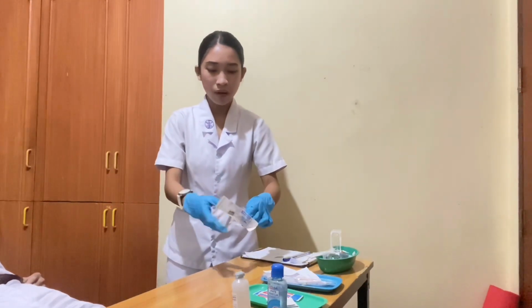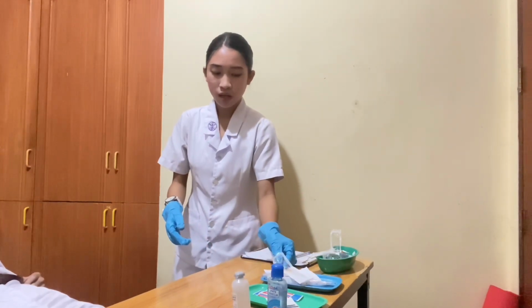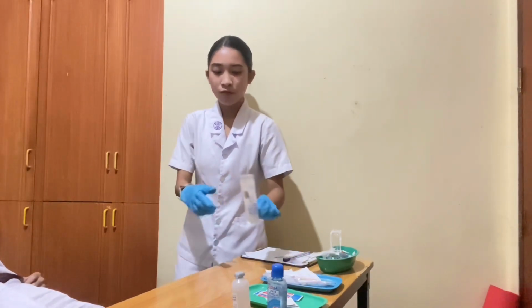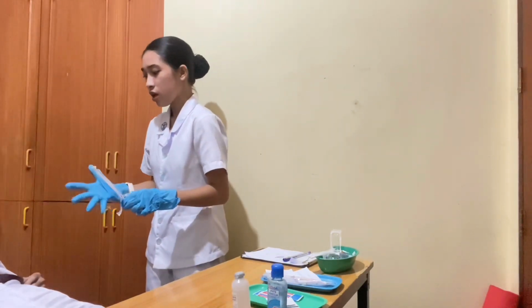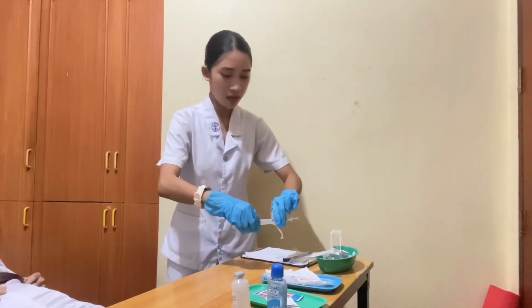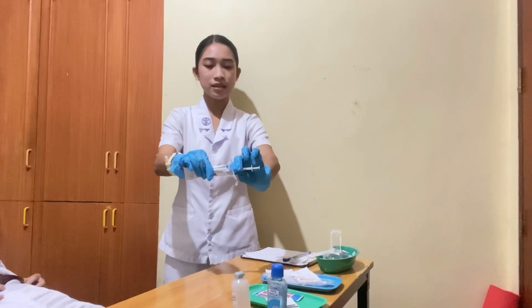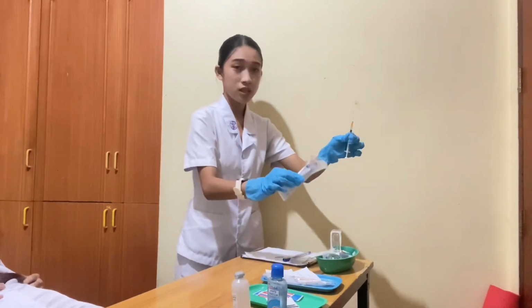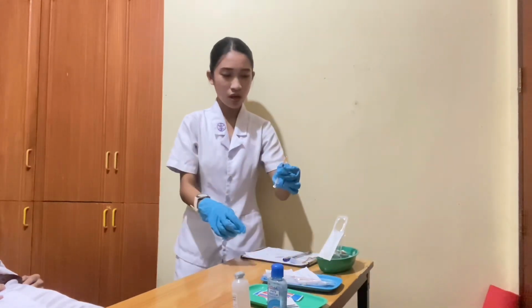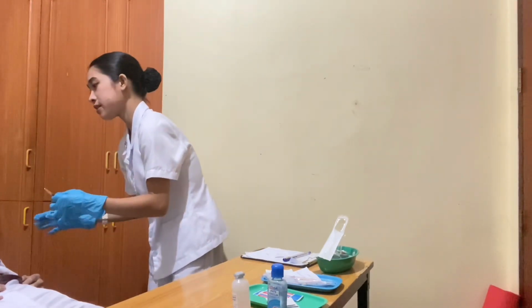Again, ma'am, this was ordered by your physician to have your insulin. Go by opening like this. Dispose to the sharp container. Ma'am, mag-inject na ko, ma'am, ha?